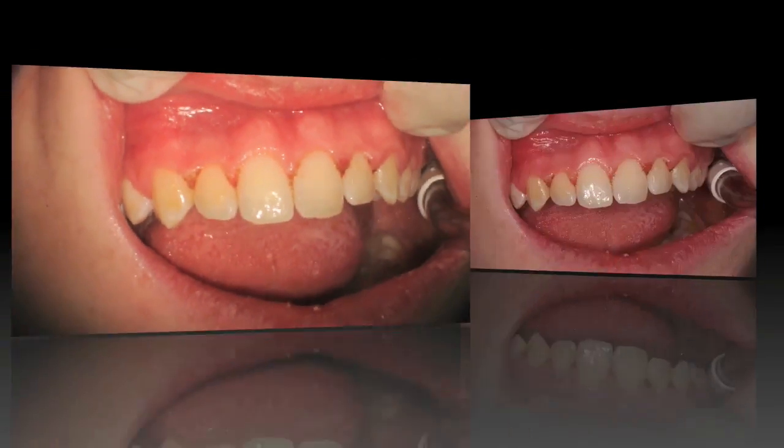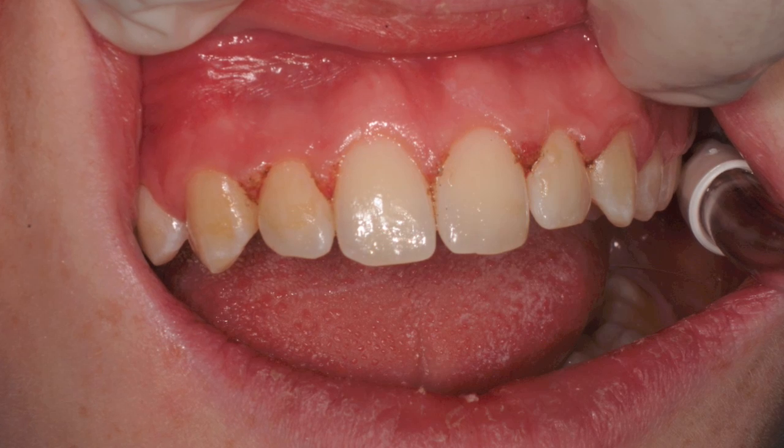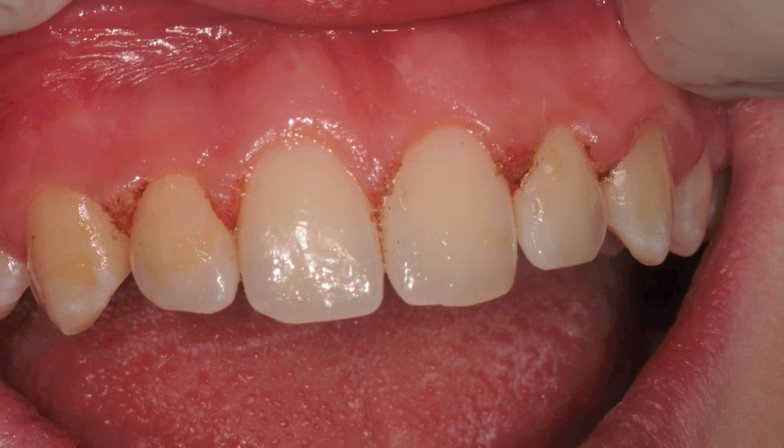Here is the immediate post-operative result. This was done today in April and you can see some higher mag views of the upper anterior teeth.